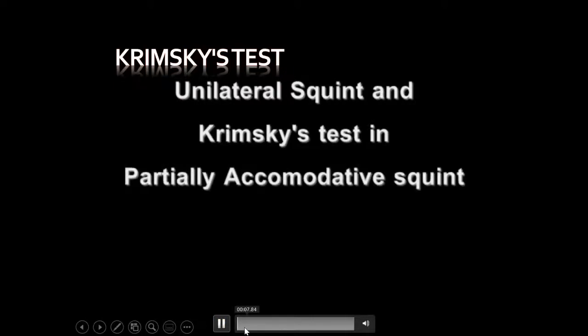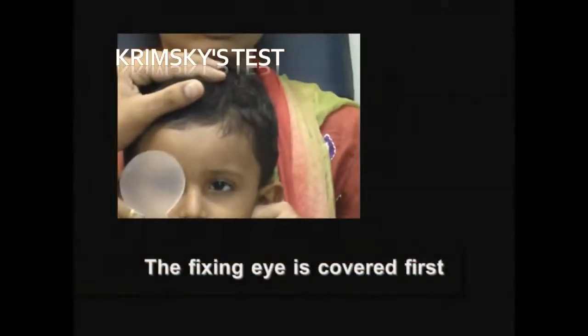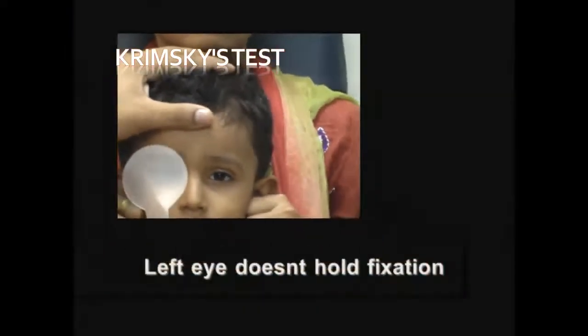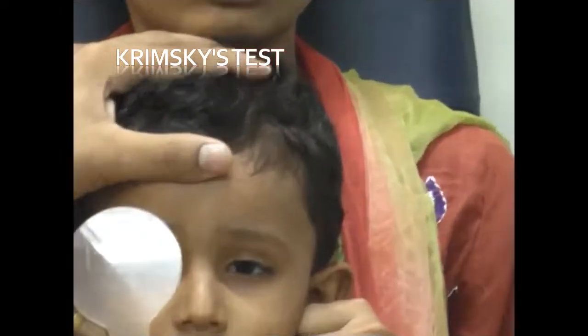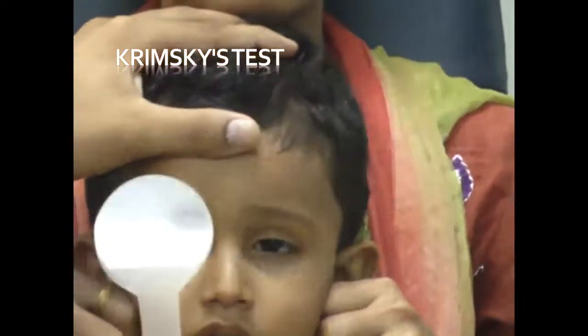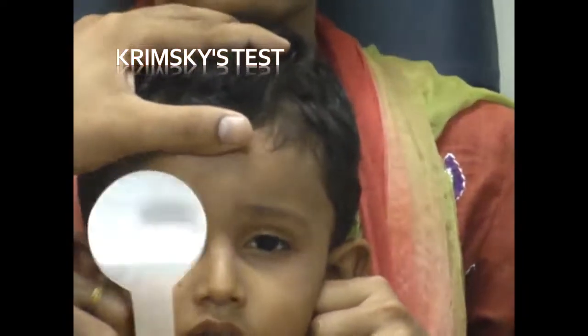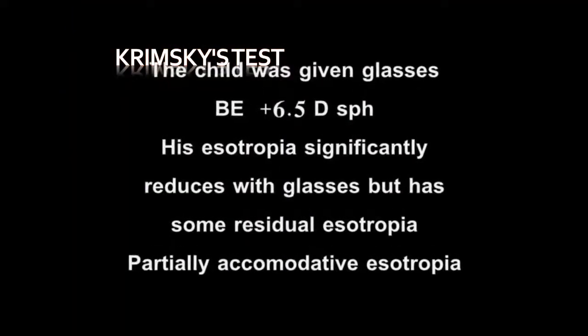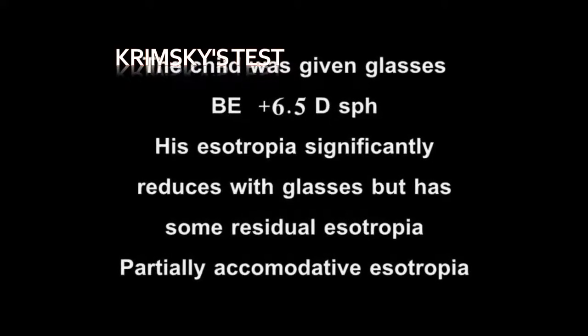Then there is Krimski's test. The mother is holding his ears. He has partially accommodative esotropia — you can see the esotropia, and his left eye is amblyopic. The left eye is not holding any fixation; the moment you uncover the right eye, the left eye goes inside. Even after giving him plus 6.5 diopter sphere, he still has some amount of deviation remaining. This is known as partially accommodative esotropia.